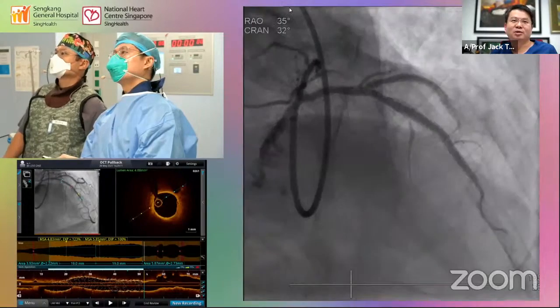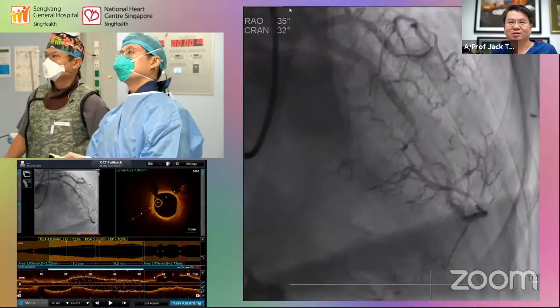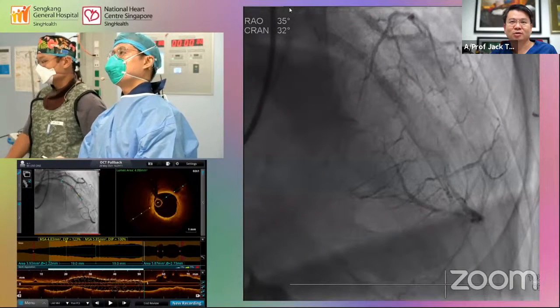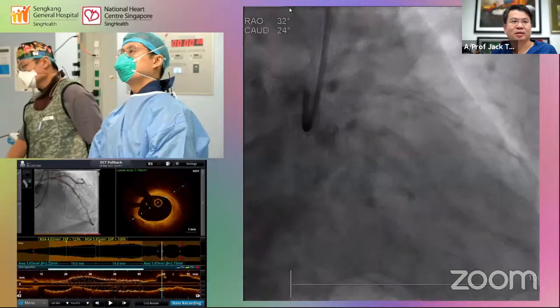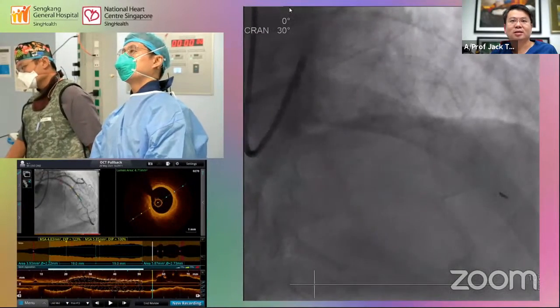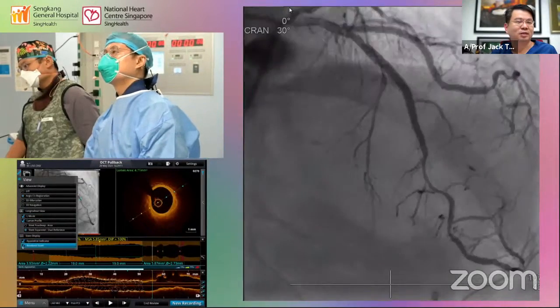The stented segment looks good, but the rest of the artery is very diffusely diseased. But I think for an 87-year-old, this is probably a very good and adequate result. So congratulations, Dr. Pham. I think it's a nice result here, a good result.